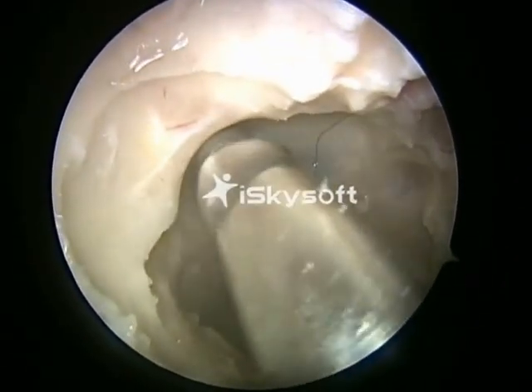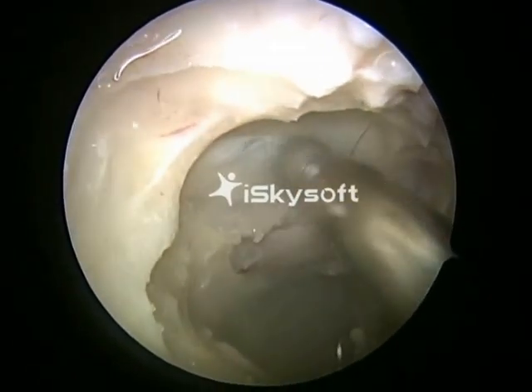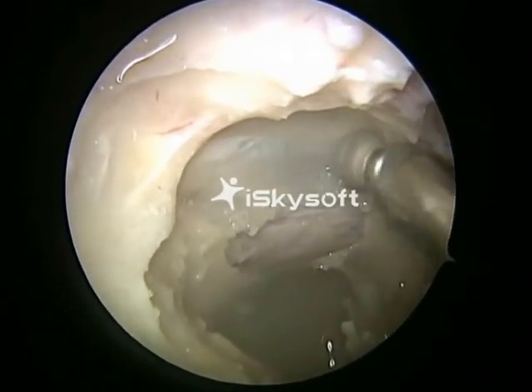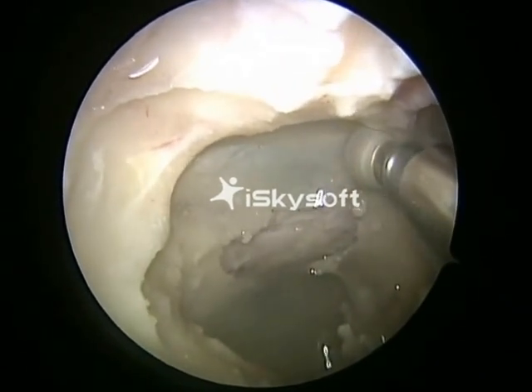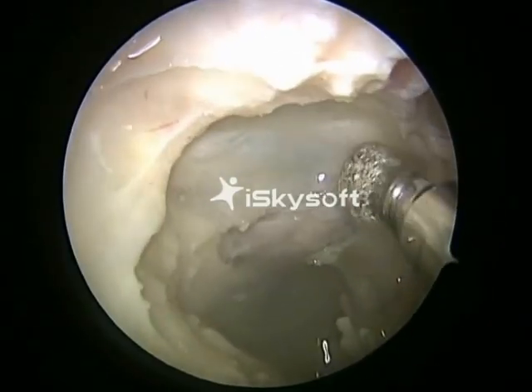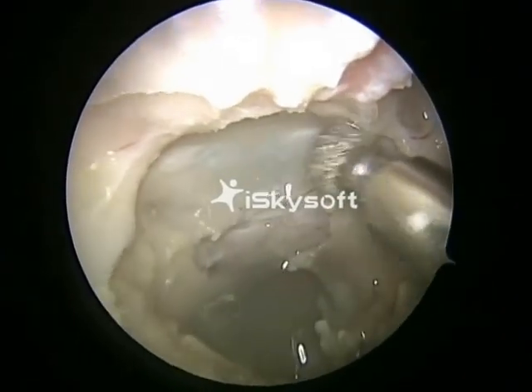And then would be a transplanum approach. To do the transplanum approach, we'll have to remove a wedge-shaped bone. The base of the wedge is formed by a line just posterior to the posterior ethmoidal artery, and the 2 sides of the triangle just above the optic canal.